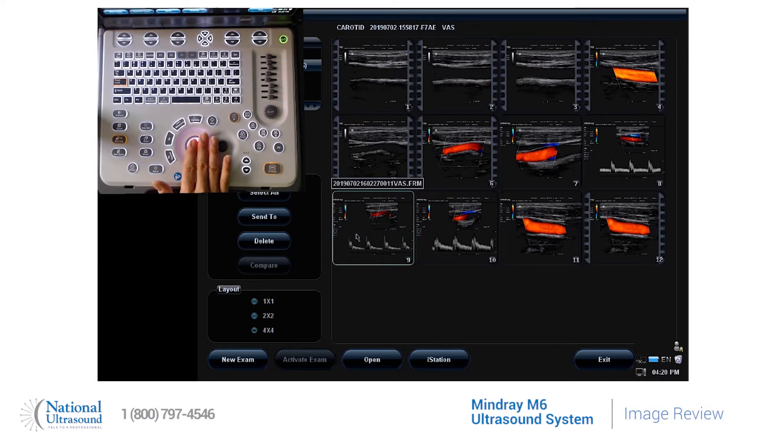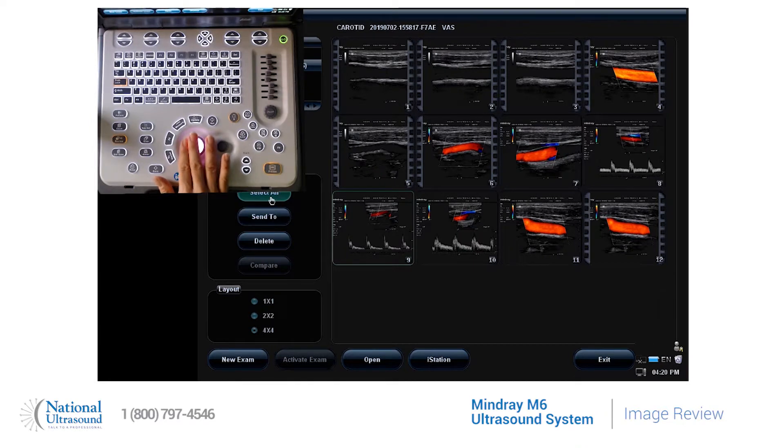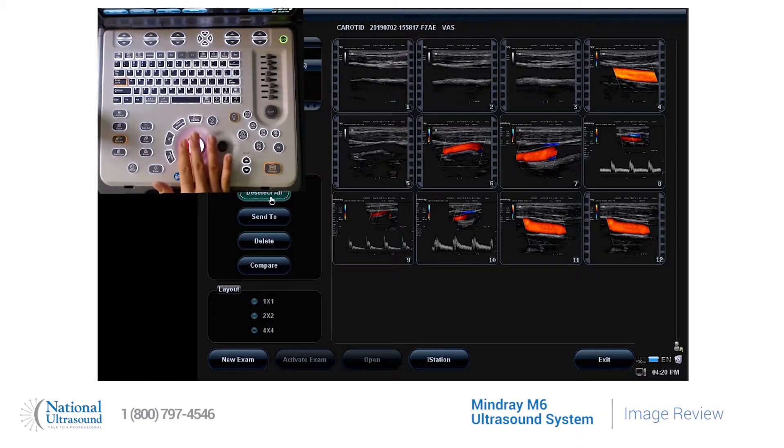By highlighting an image, you can delete. You can select all and delete.